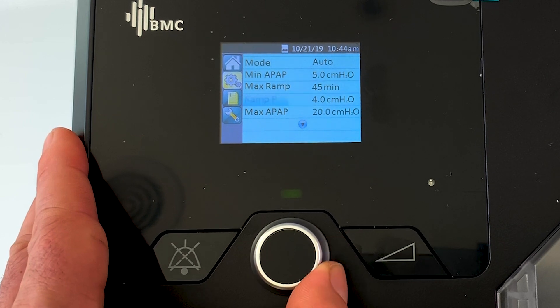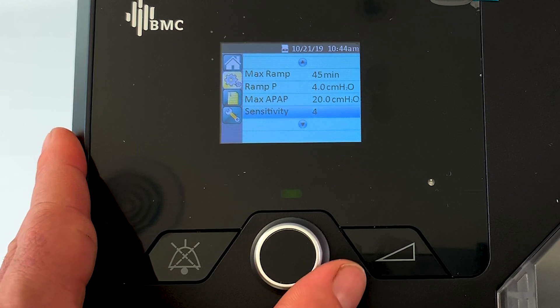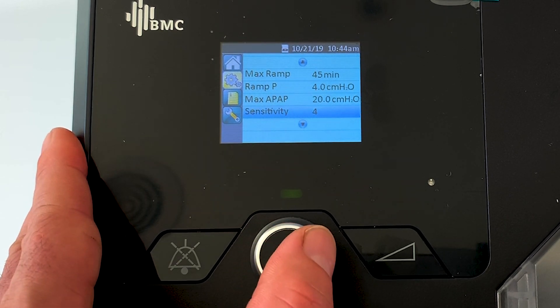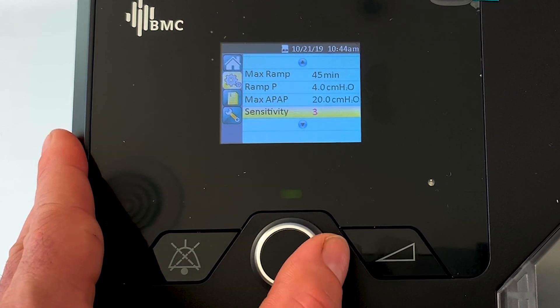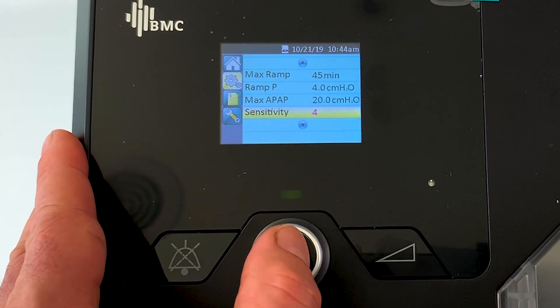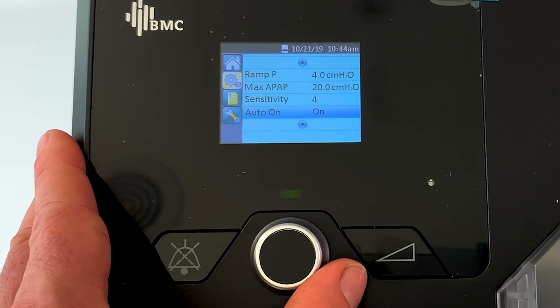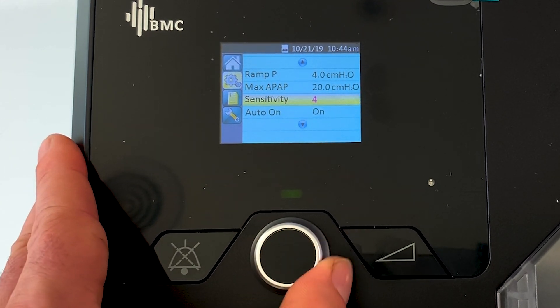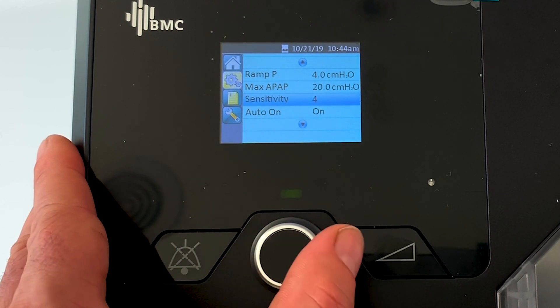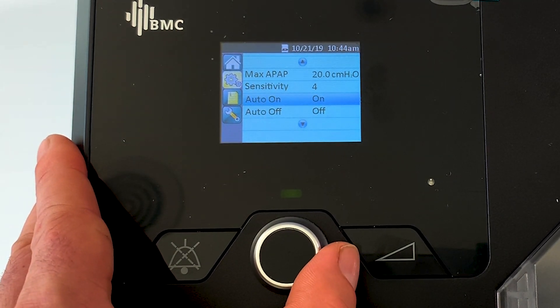Coming down to sensitivity - I recommend you leave it on four. This is how sensitive the machine is to your apnea and how fast it's going to make changes. If you go down to three or two, the pressure is going to change over a longer lag period. You want it nice and sensitive to your apnea. If you're finding the pressure fluctuations are a bit too quick, you might want to bring that down to three for more gradual pressure changes.